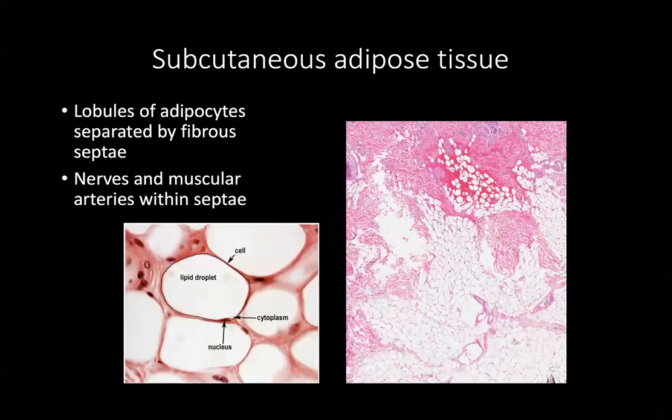Subcutaneous adipose tissue is where you get a lot of the cushion of the skin, actually. If someone's pressing on the skin, that give and take, that bounce back, a lot of that absorption is actually in the subcu. This is where subcutaneous adipose tissue deposits during weight gain, or during the development of lipomas, or liposarcomas. It all arises essentially from this subcutaneous adipose tissue.